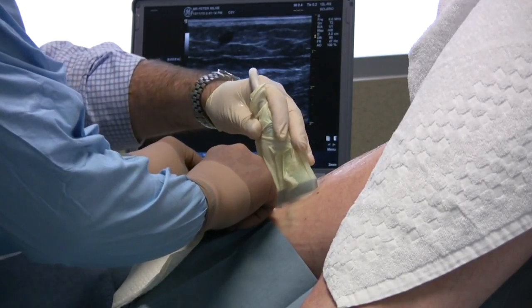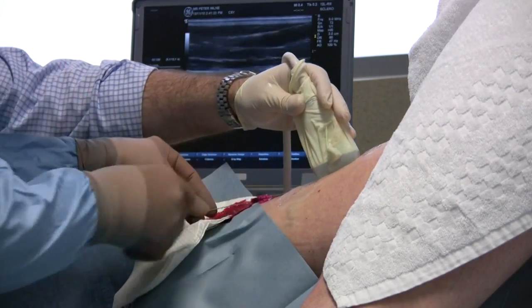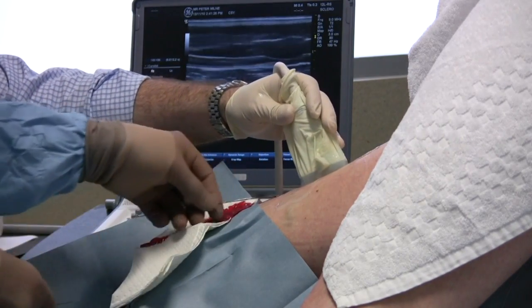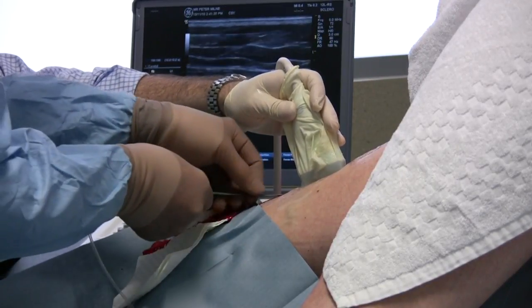All of this, as you can see, is done with ultrasound guidance, the imaging confirming access of the vein with the wire. You can follow here the introduction of the access sheath into the vessel.